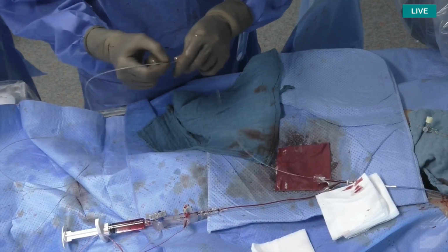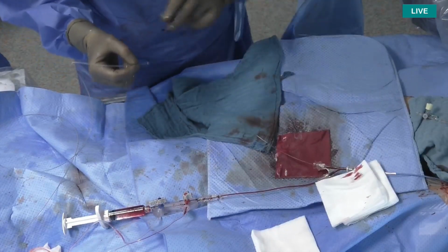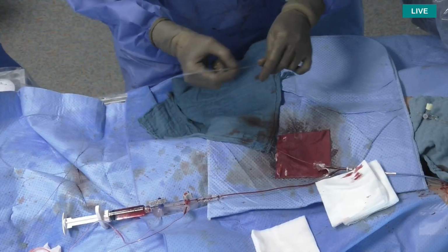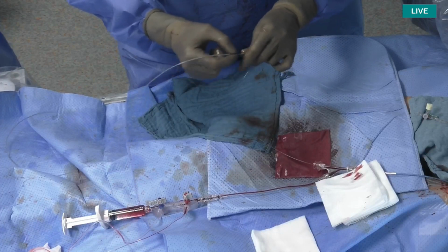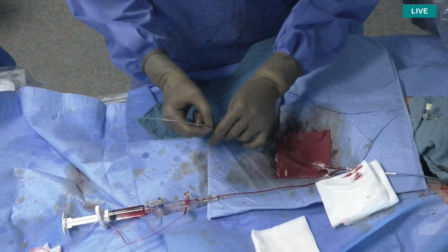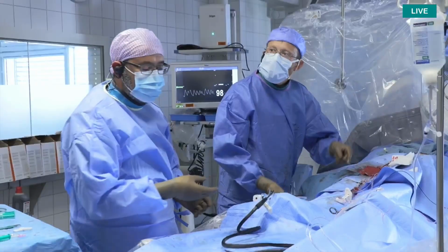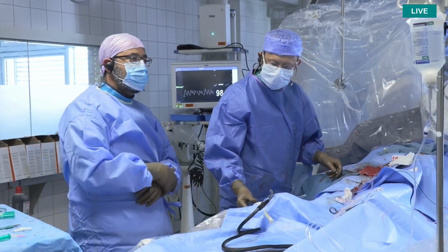In clinical practice, at least in the last few years, there is some research in more aggressive atherectomy. We have trials in the past that showed us that we shouldn't exceed a burr-to-artery ratio of 0.7.